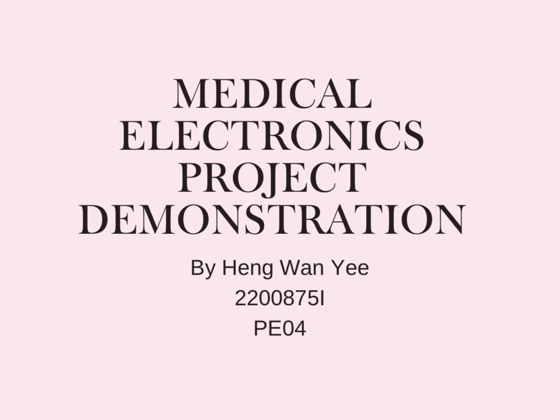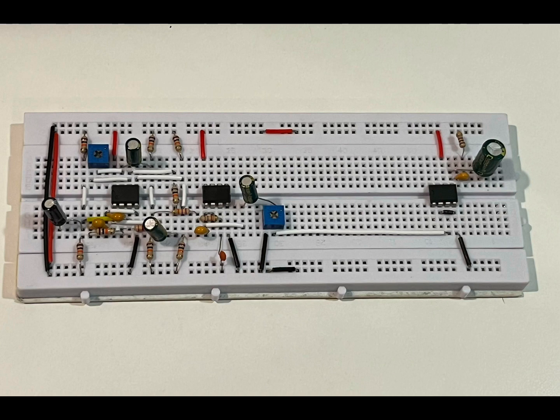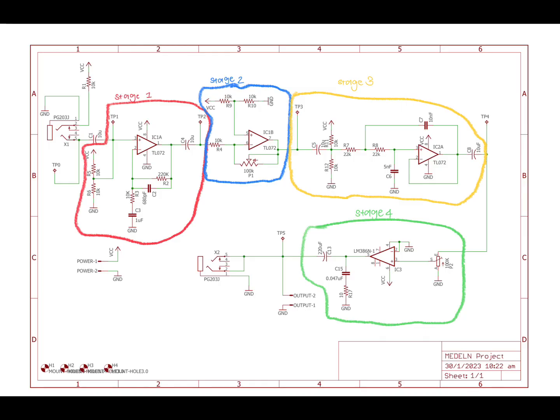Today, I will be explaining my medical electronics project. This is my circuit and it's supposed to obtain the sound output from a stethoscope which completes to be a biomedical processing system. For simplicity, the schematic diagram is split into 4 stages. Stage 1 consists of TP1 to TP2, Stage 2 consists of TP2 to TP3, Stage 3 consists of TP3 to TP4, while Stage 4 consists of TP4 to TP5. I will be explaining my circuit in stages.